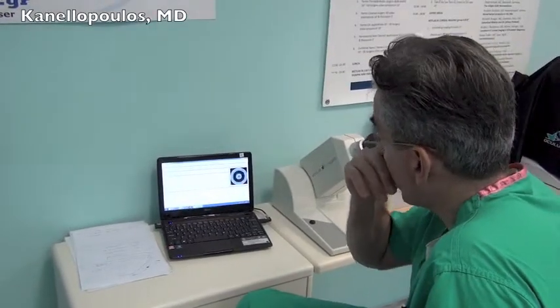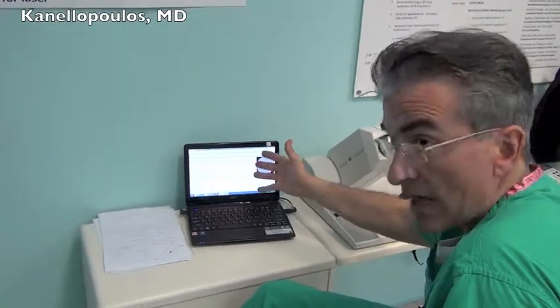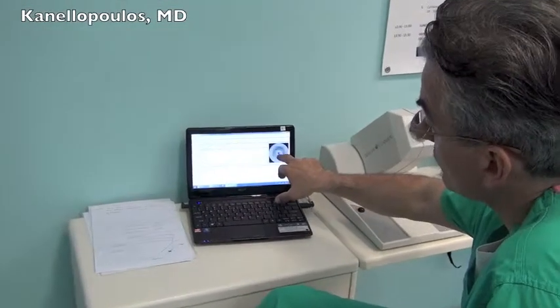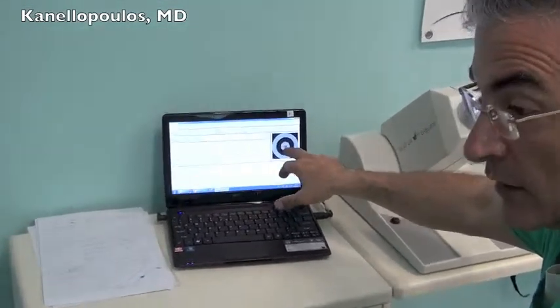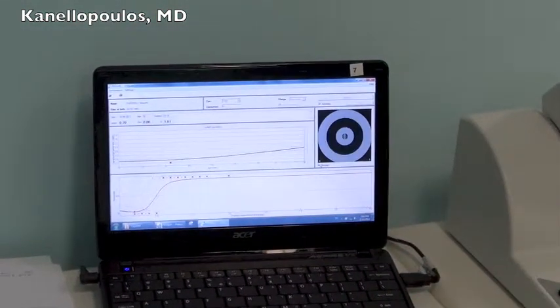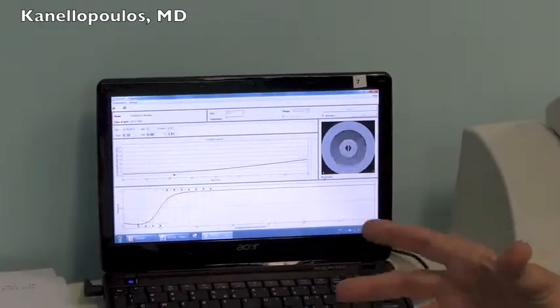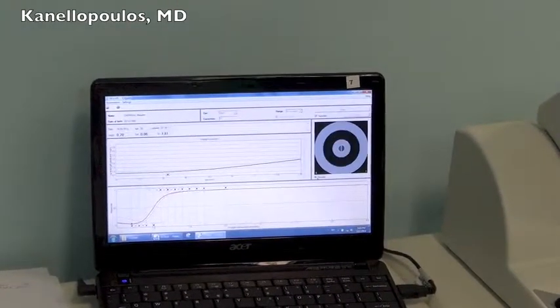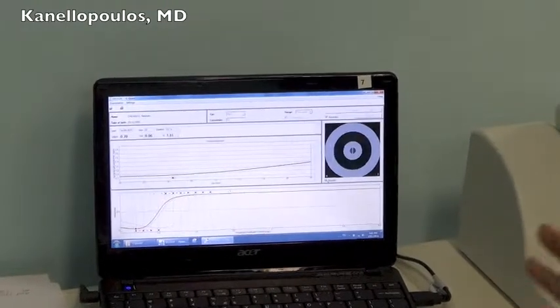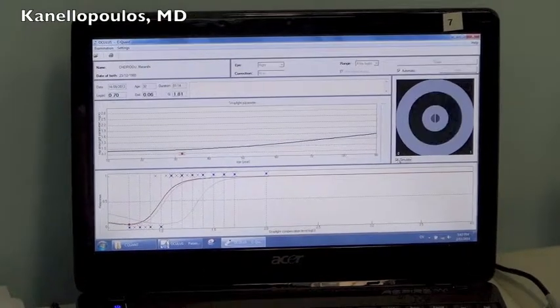Okay, so again, just to note that in reality, only one half of this central circle flickers, and it might be perceived by the person being examined that the other half flickers as a result of ocular scatter within the eye. So this is how this psychophysical measurement is trying to establish the ocular scatter.